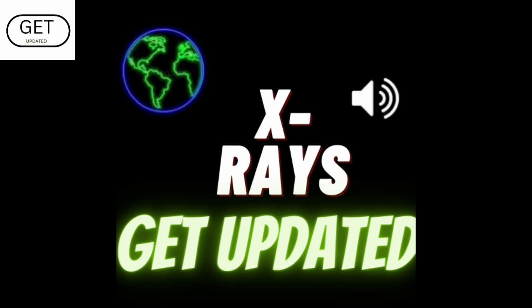This tube contains a cathode and an anode, which are connected to a high-voltage power supply. When a high voltage is applied across the tube, electrons are emitted from the cathode and accelerated towards the anode. When these high-speed electrons collide with the anode, X-rays are produced.